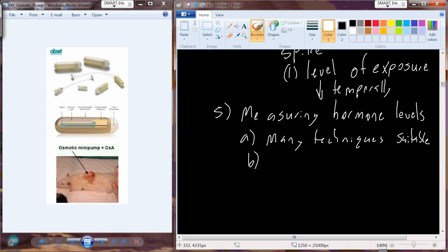We've already talked a little bit about quantification because we looked at the Yalow and Berson experiment with the development of the radioimmunoassay. And so that's one option. What I see more commonly is a technique that's known as EIA or an ELISA. So these are more common today.